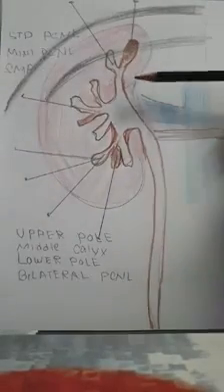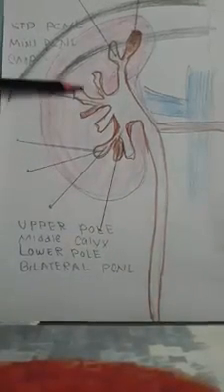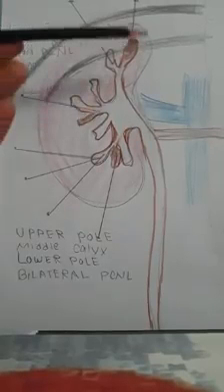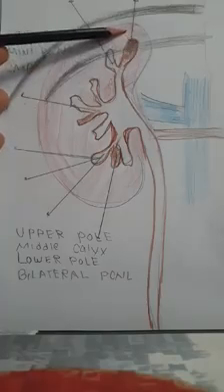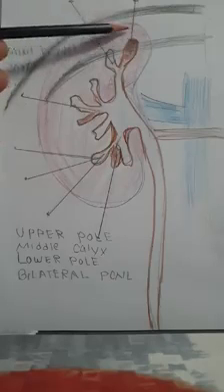And also sometimes I use a mid-pole puncture. Mid-pole puncture is also a very effective way of doing a puncture, just like a superior pole. The advantage is you don't have to go all the way up to the kidney, because there is less chance of having pleural complications.